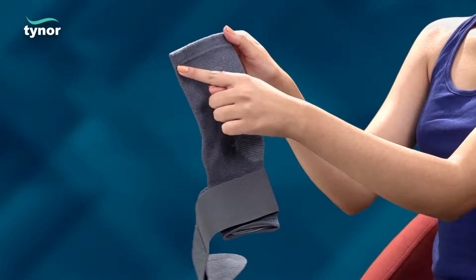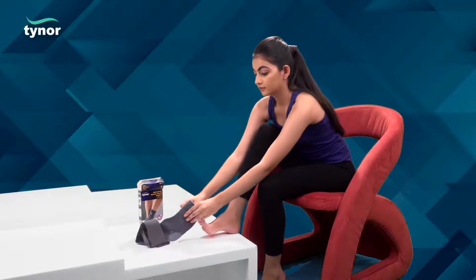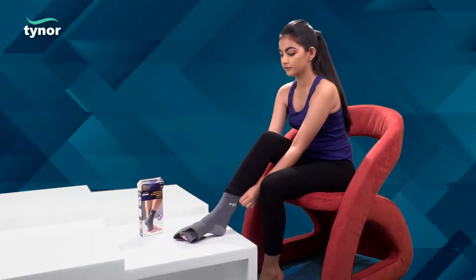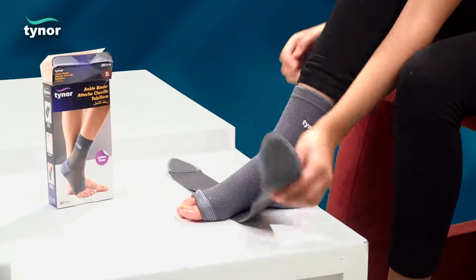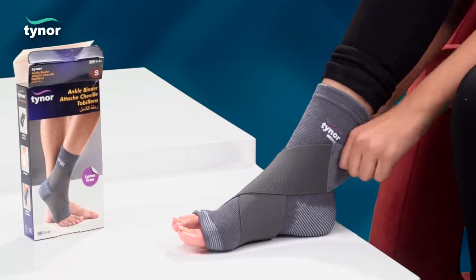With the longer half upwards, wear the compression sleeve with a pull-on action. The striped portion should be aligned around the heel for perfect fit. Wrap the elastized strap around the ankle in a figure of 8 shape. Affix hook loop straps to a comfortable compression.